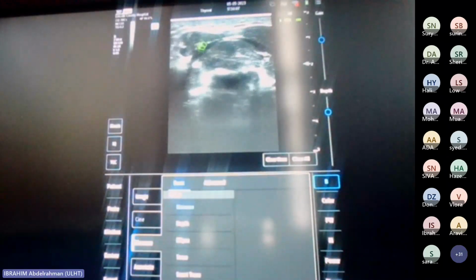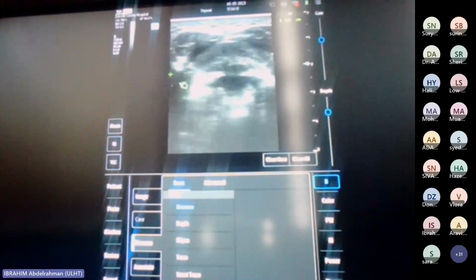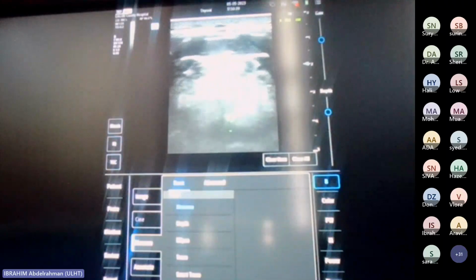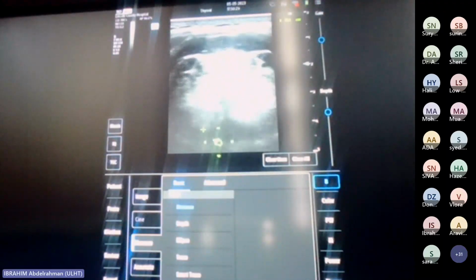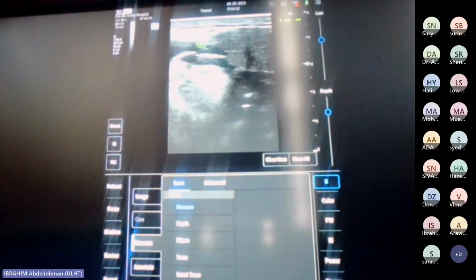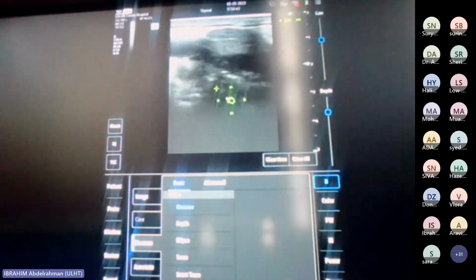That's the anterior belly of the digastric. There's the mylohyoid, geniohyoid, you see really nicely. Sublingual glands, which you can see really nicely. And then this is the hyoglossus, which you should see coming all the way to the base of tongue there. So if there was a big base of tongue lesion, you would see it. And then something laterally: this is the submandibular gland, mylohyoid, hyoglossus. If there was a dilated submandibular duct, you would see it between the two muscles there. And if you come down a little.